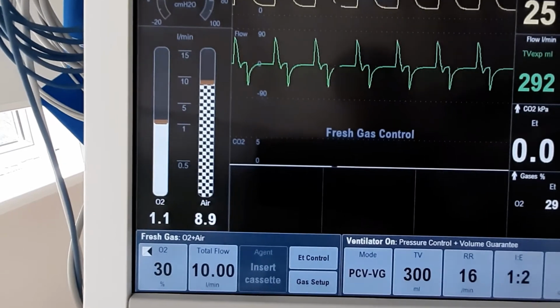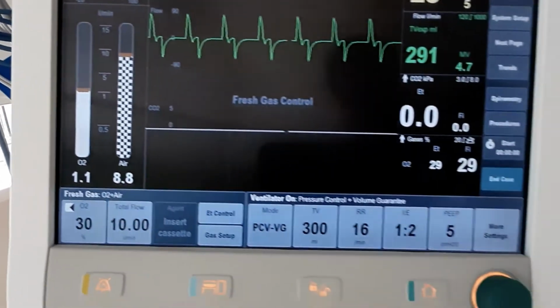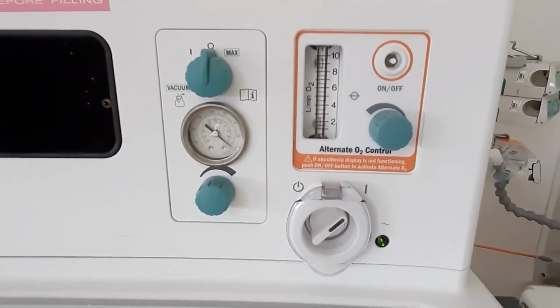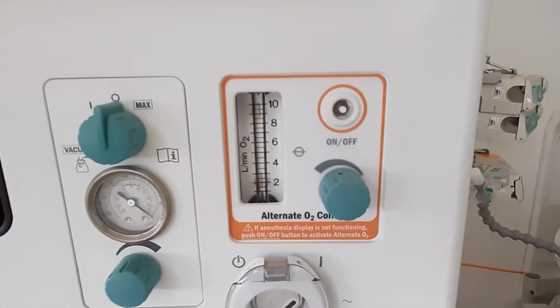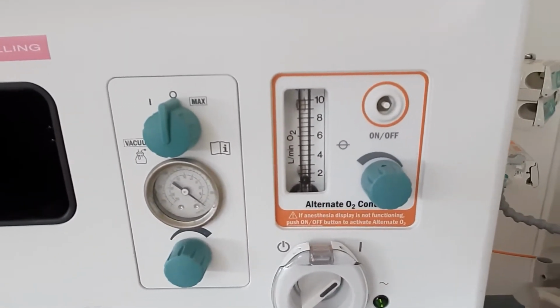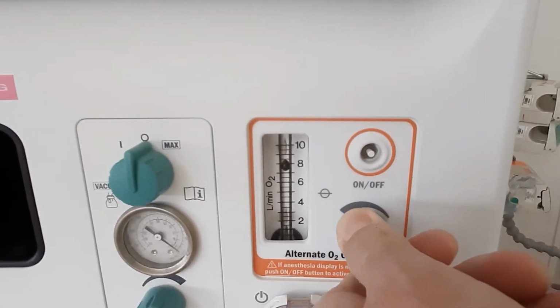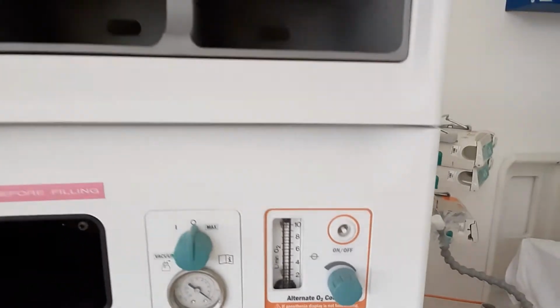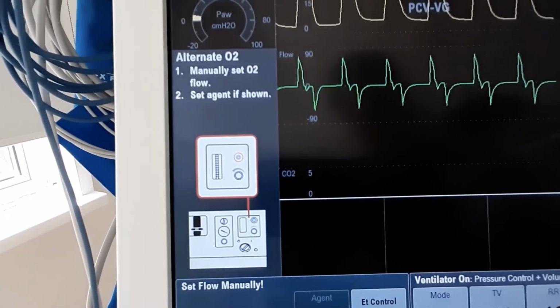Oxygen and air are mixed electronically in order to achieve our desired FiO2. This also can fail. Should this happen, the emergency alternate oxygen control on the front of the anaesthetic machine needs to be activated. In order to do this, press the little button and turn the manual flow meter to full, which is 10 liters per minute. A message on the screen will confirm the activation.